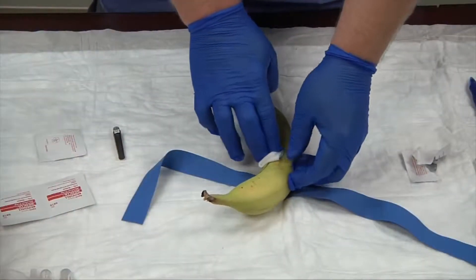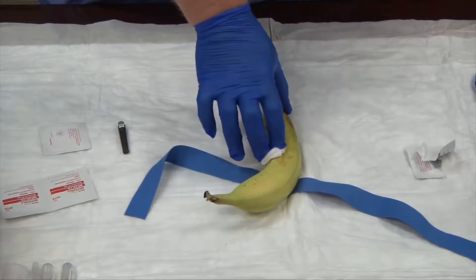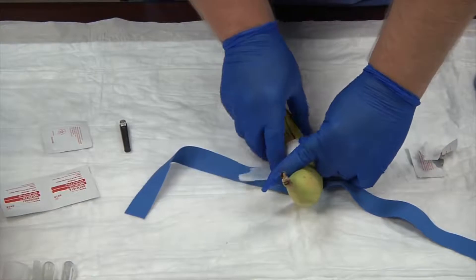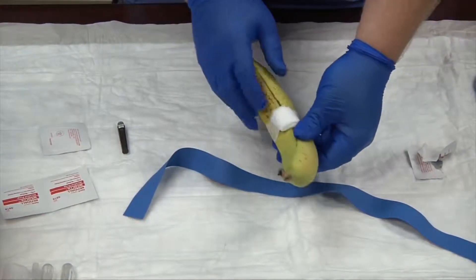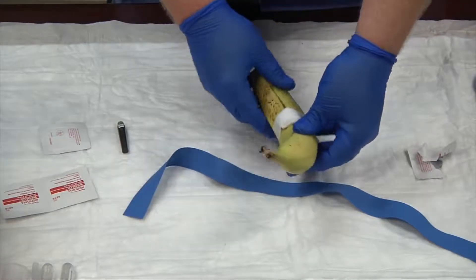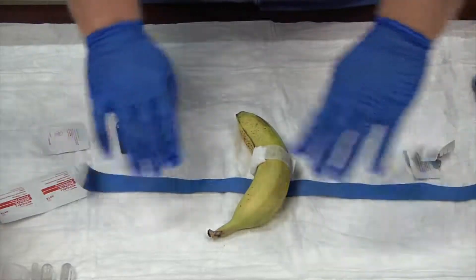I'm holding direct pressure on my site for a few moments. I have tape already torn and ready to go. Now we're going to bandage our patient, making sure we have a good tight seal — tight on the bottom and tight on the top. And that's how you can practice doing a phlebotomy blood draw on a banana.